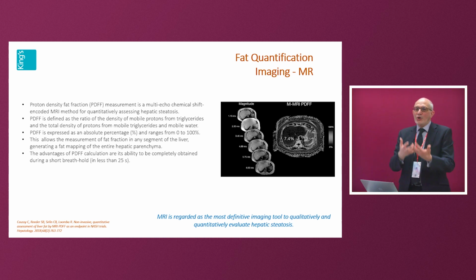But whether that global view is useful to the treatment of the patient is another matter, because you've previously been treating fibrosis on that small sample successfully. So does it make a difference if it's variable across the whole liver or not? That's a philosophical question. And the same now with fat quantification.